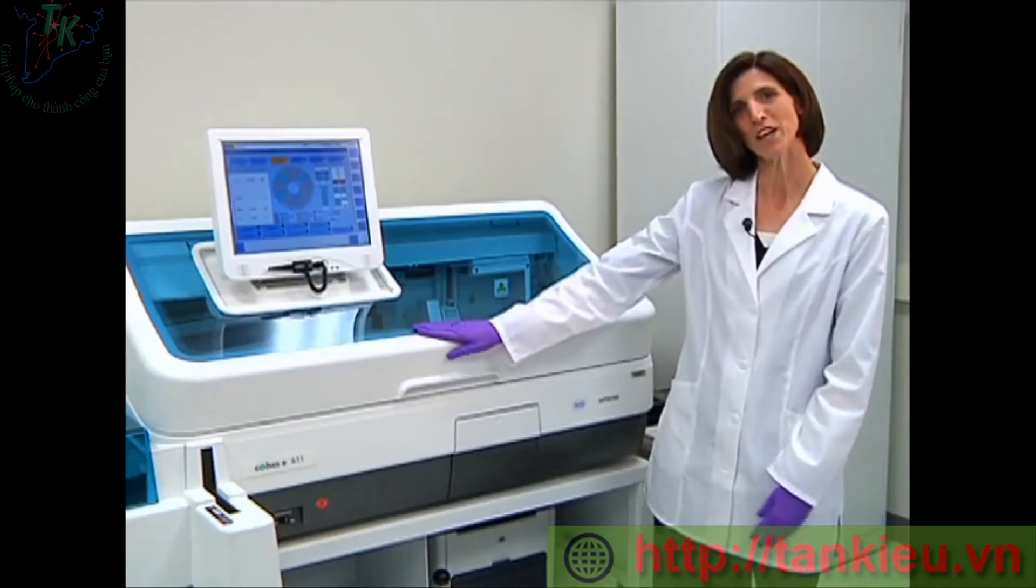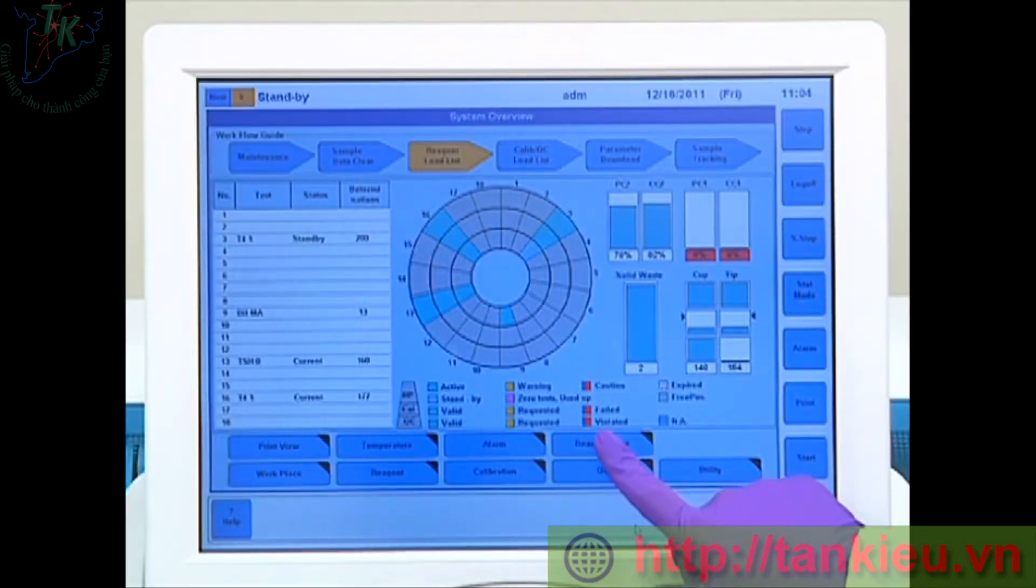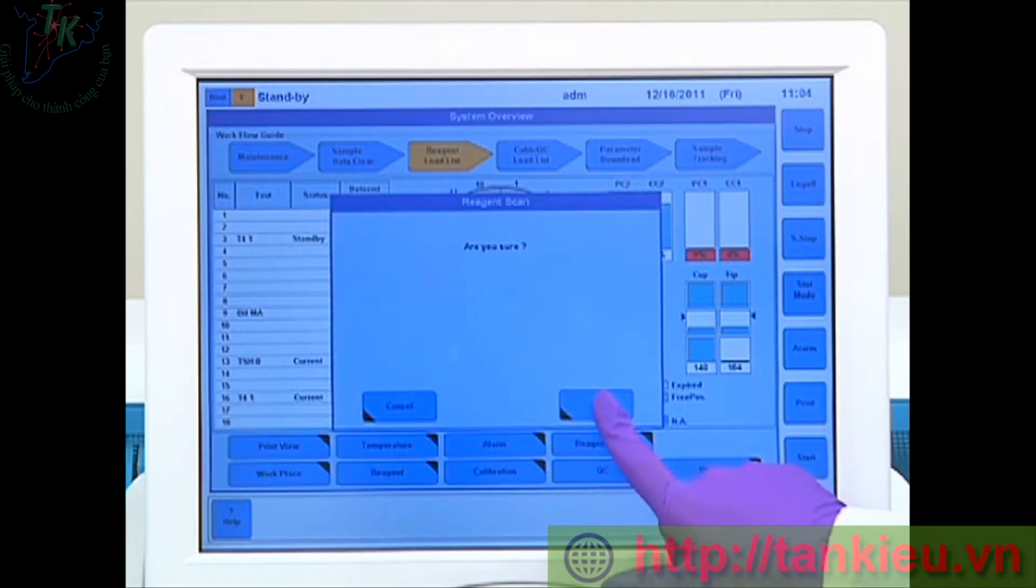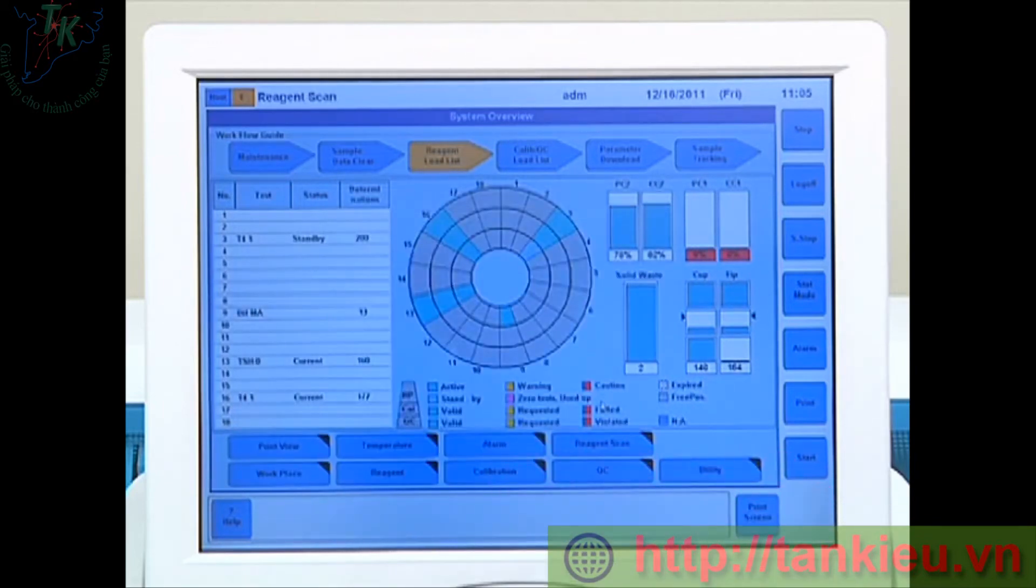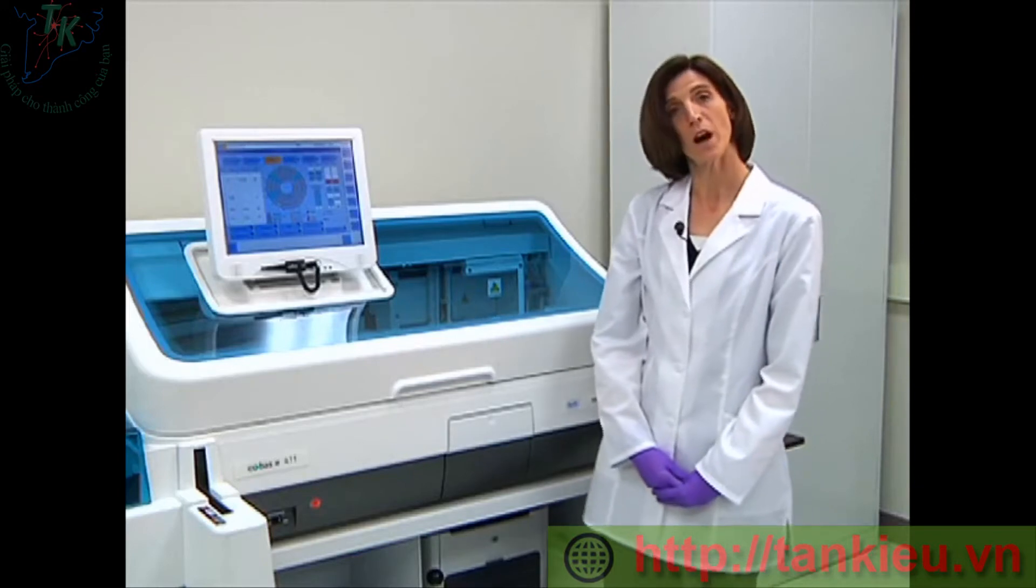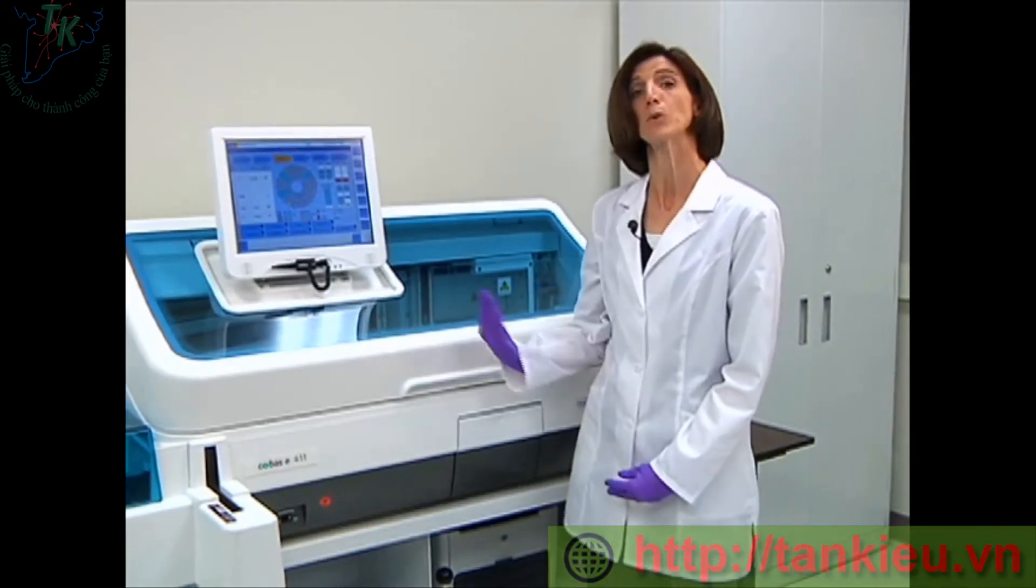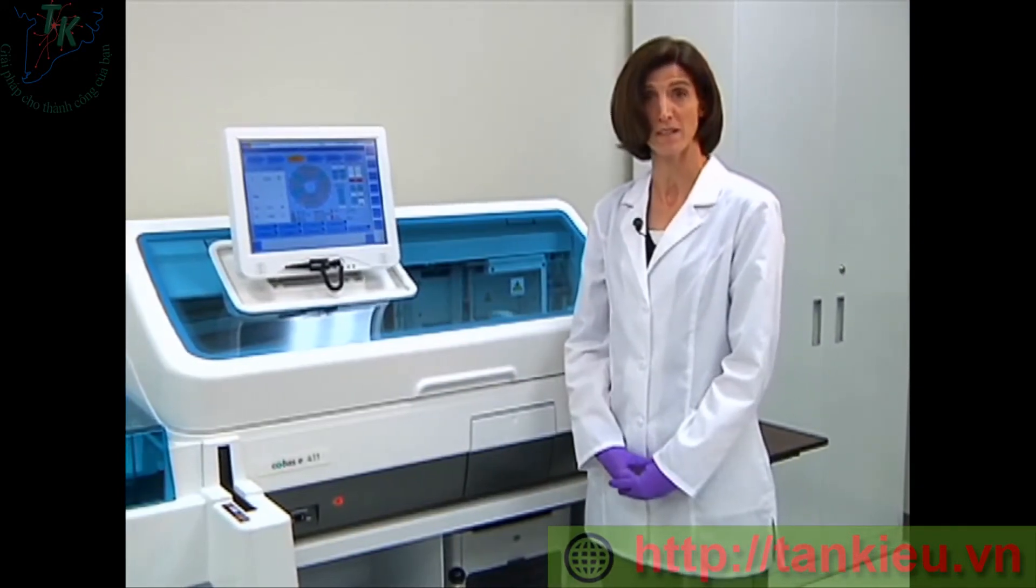Since we've loaded our reagents, now we're ready to perform the reagent scan. That's just a simple push of the button. And what the instrument is going to automatically do is do a complete reagent inventory of all of the packs that I have loaded.